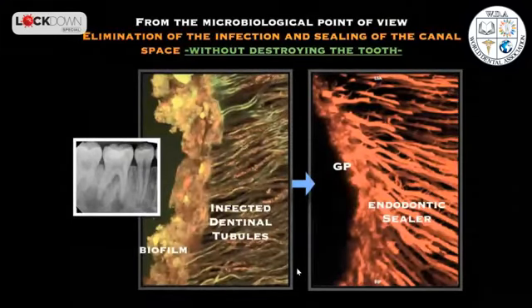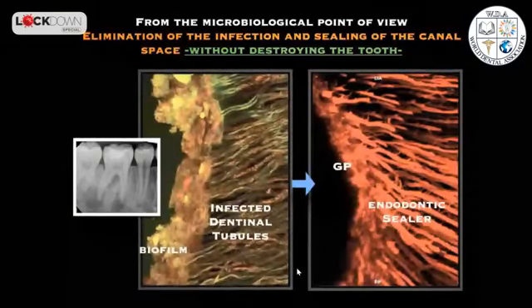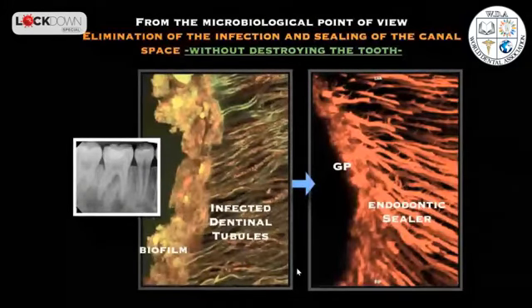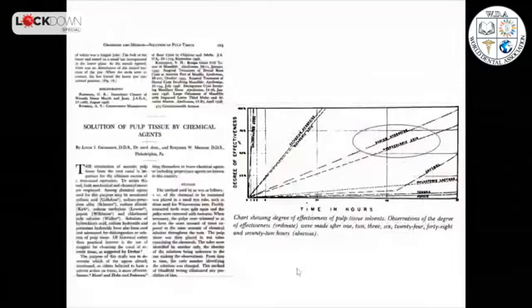And once we assume that the tooth is already clean from the inside, we need to seal the root canal space. As you know, the mouth is a very contaminated area, so we just want to avoid leakage inside the root canal. To obtain this goal, we are going to use gutta percha and sealer. The gutta percha and sealer basically prevent the recontamination of the root canal space after the cleaning and shaping.